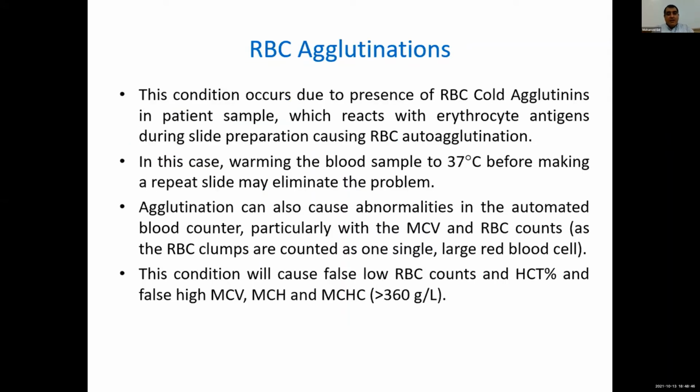RBC agglutination occurs due to presence of cold RBC agglutinins in the patient sample, which react with erythrocyte antigen during slide preparation causing RBC autoagglutination.